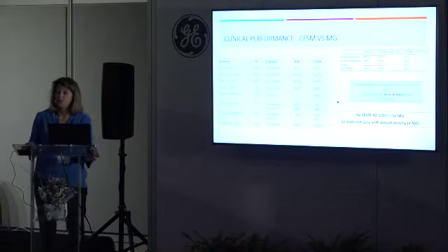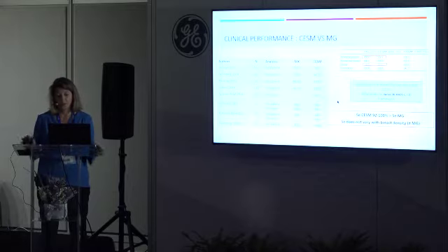So, clinical performance. In the literature, some papers have been published, this one from my hospital since 2011. If we compare contrast mammography to mammography, and to mammography plus ultrasound, this technology improves cancer detection and specificity. So sensitivity and specificity are better with contrast mammography in comparison with mammography. And one of the interests is that this improvement does not vary with dense breasts, because we know that dense breasts are a bit complicated to interpret, and we can have false negatives.